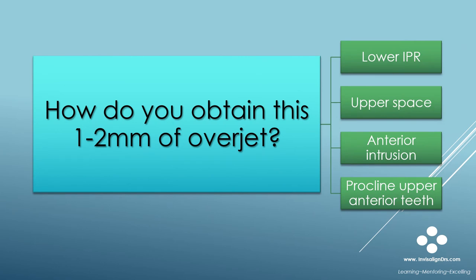How do you obtain one to two millimeters of excess overjet in ClinCheck? You can increase the overjet by performing one or a combination of the following: lower IPR, leave some upper spacing, anterior intrusion of upper or lower anterior teeth or both, and by proclining upper anterior teeth. Usually I use a combination of these. The use of ClinCheck Pro's 3D controls is the preferred method to add these to a ClinCheck.